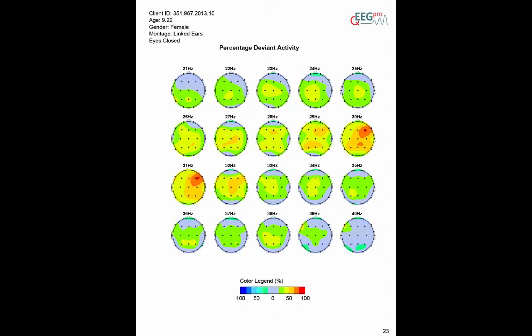In the current example, the percentage of the recording in which the power around 30 Hz at right frontal electrode sites is above 2.3 is relatively high.